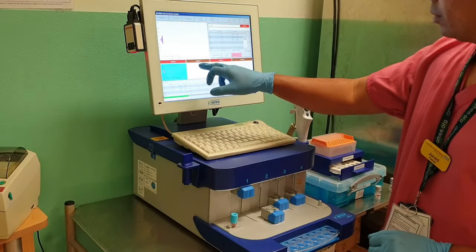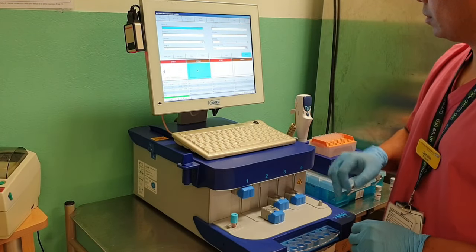If you want to run a FibTEM at the same time, then just select the FibTEM channel, press start, and follow the instructions.